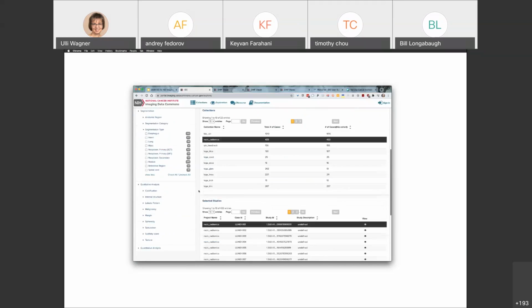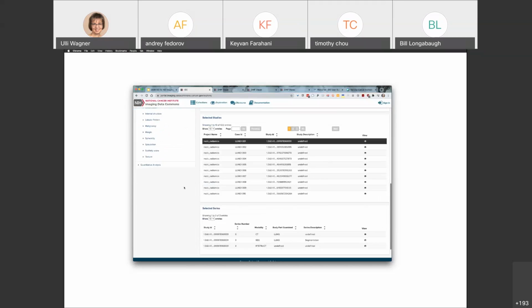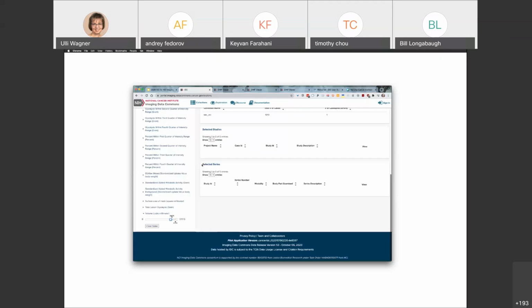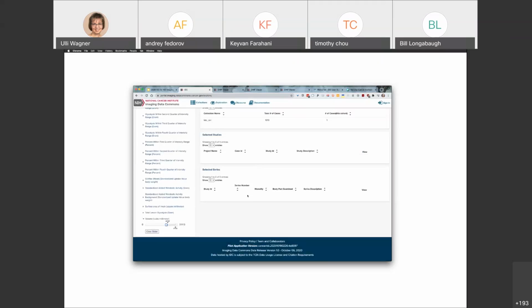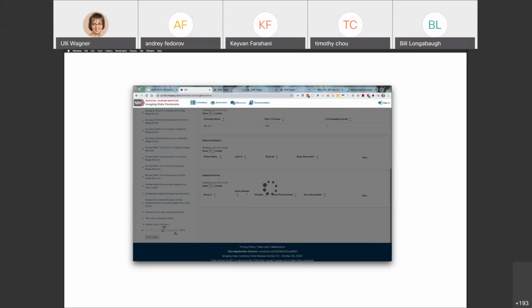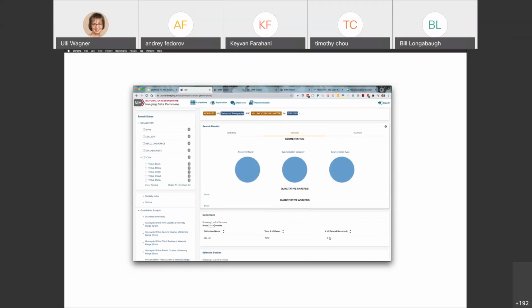So here again, I start with selecting just CT images, but then I will select only the subset of the cohort that has segmentations of certain volume. So let me just adjust this a little bit. Okay, so let's say here I have the cohort of just 4 cases, as you can see here.